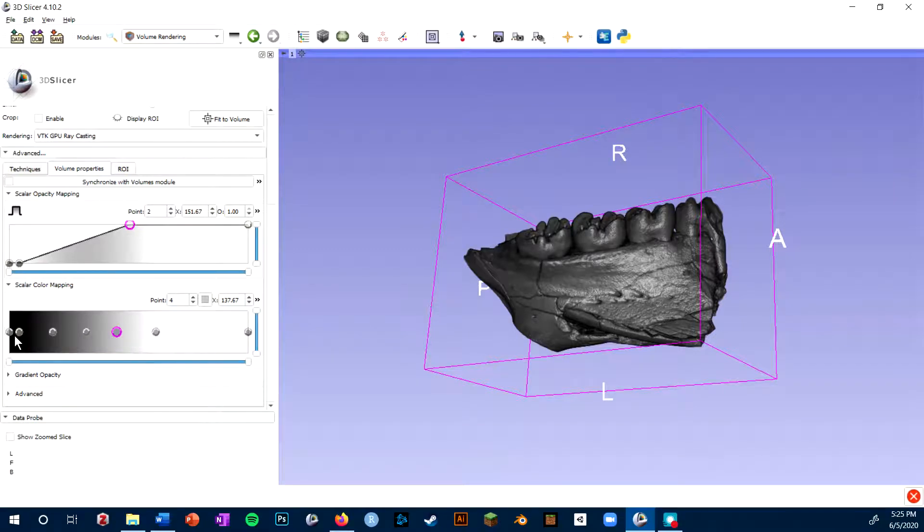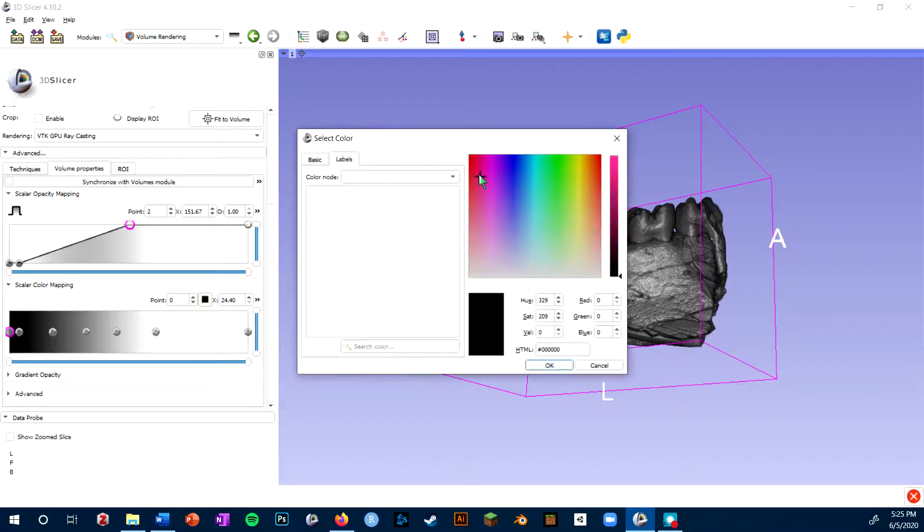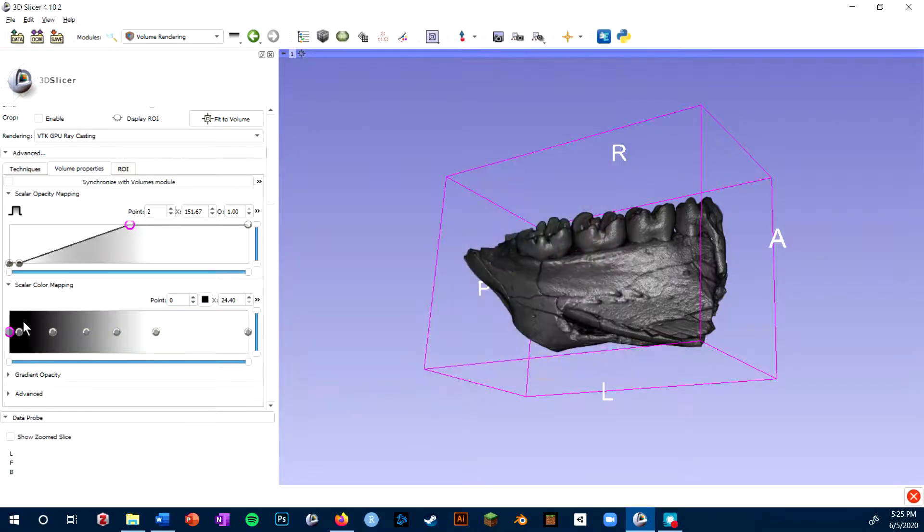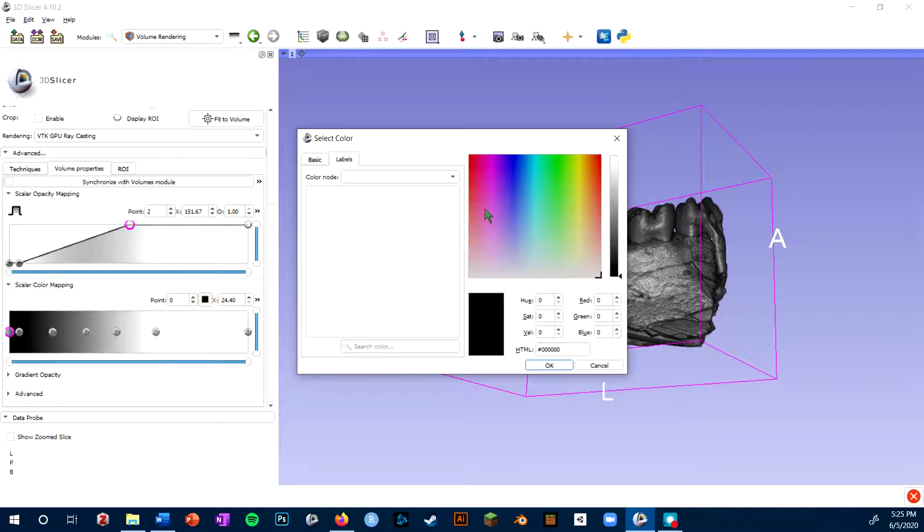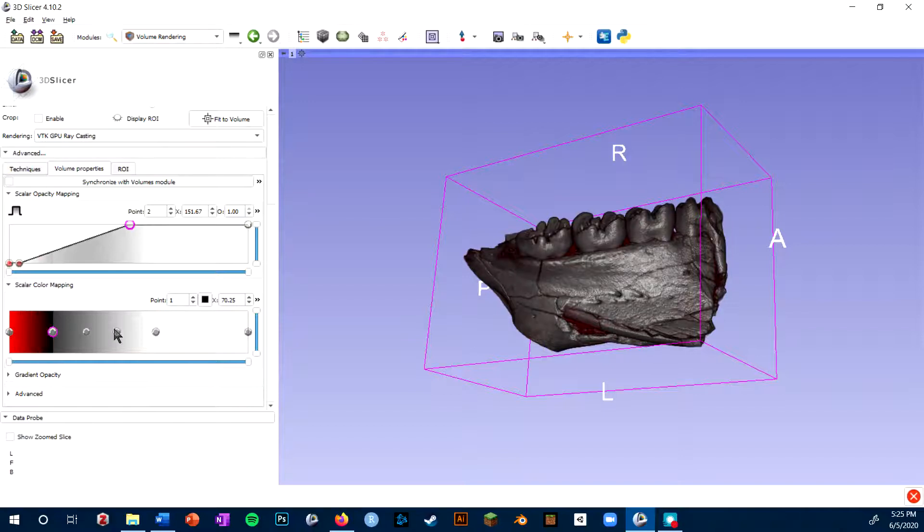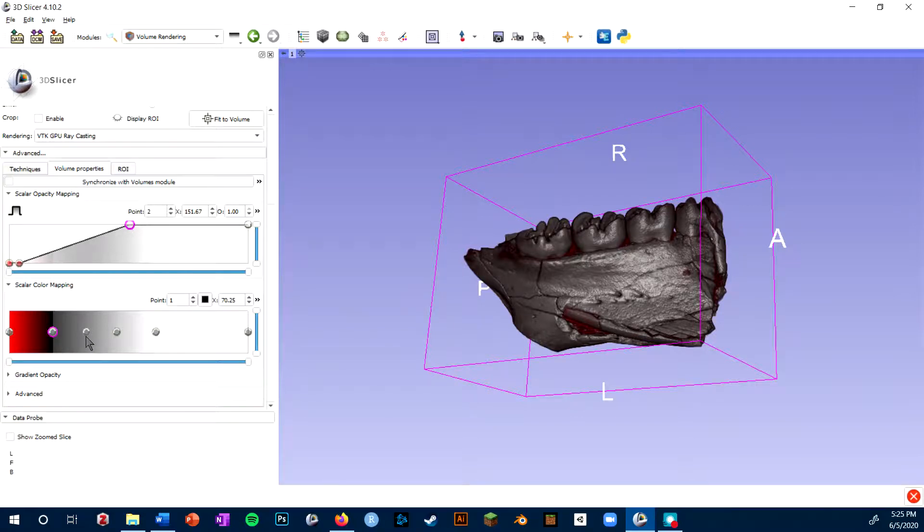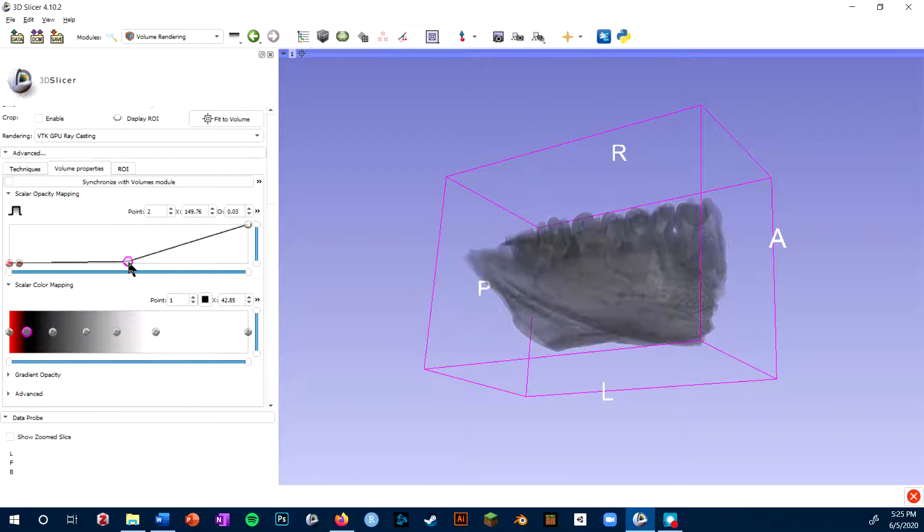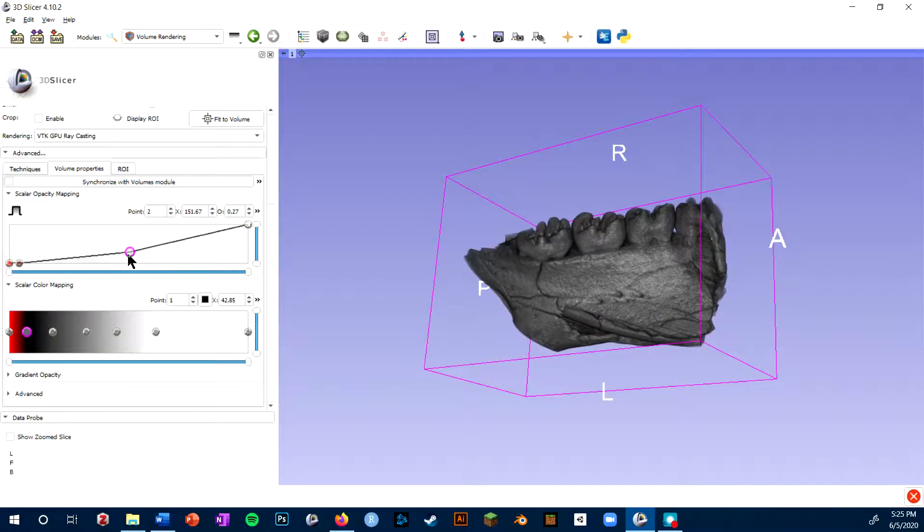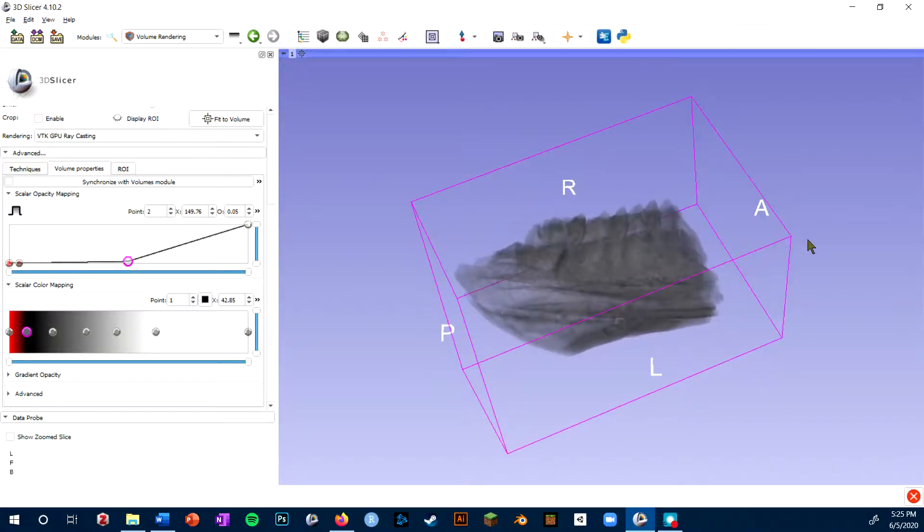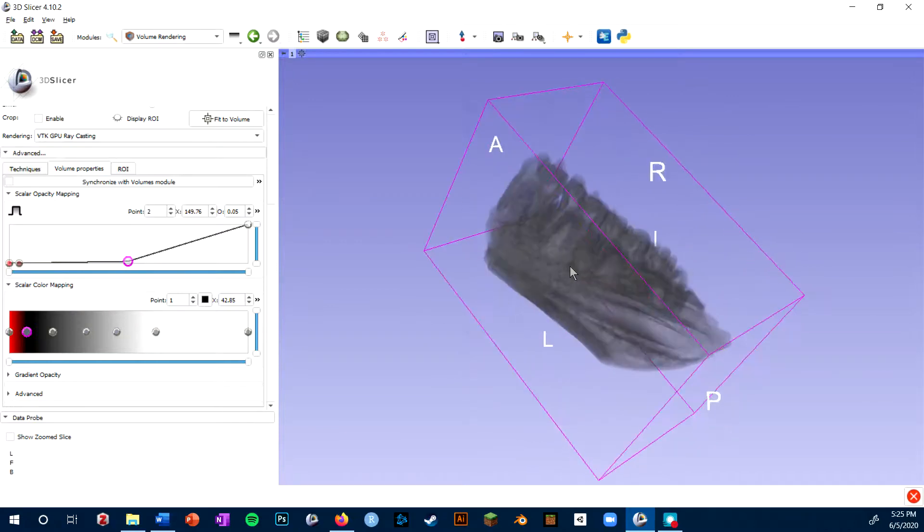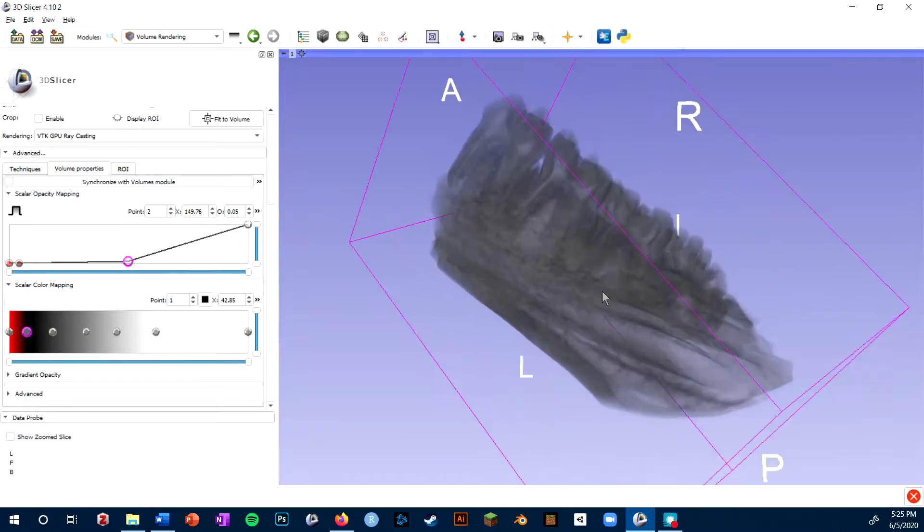So for instance, if I wanted to, I could change this very base color. And then as I adjust, you can see that those lightest densities I have showing now are turning red. Similar idea with the opacity. If you want to be able to see through and see the roots of the tooth in your rendering, you could adjust the opacity down there.